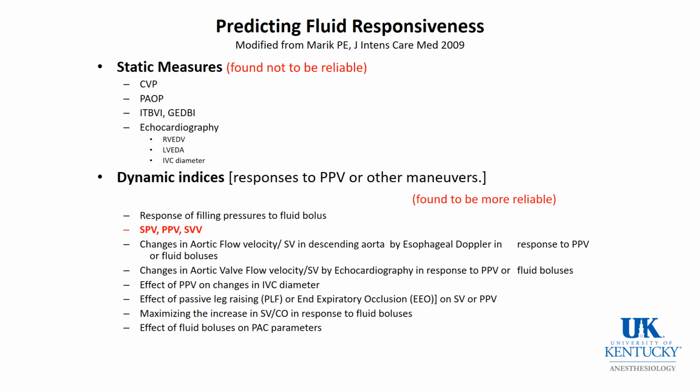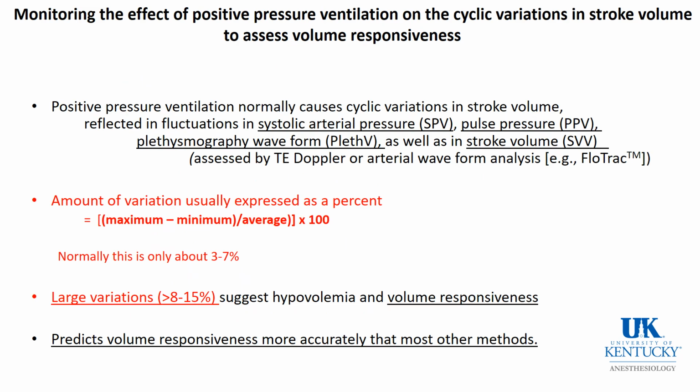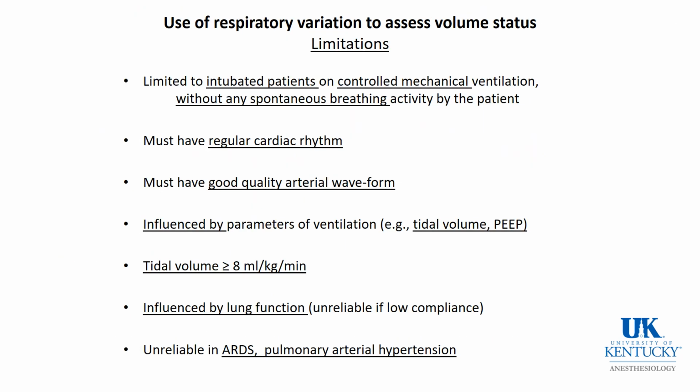pressure. I left off a few things here. Limitations: one is it's perhaps not reliable during one lung ventilation, and there's some question during laparoscopic surgery. So there are lots of limitations of this method, but under ideal circumstances, it's useful.